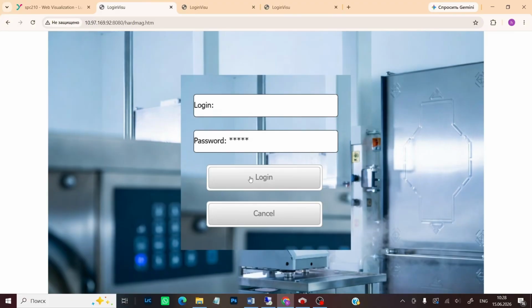What's the difference between a dialog window and a regular visualization? In a dialog window, the PLC receives all the client's data only after the login button is pressed. In the case of a visualization, the data would be sent immediately after each new value is entered. As a result, other browser clients could see someone else's data. However, this data leakage can be fixed even in this case.